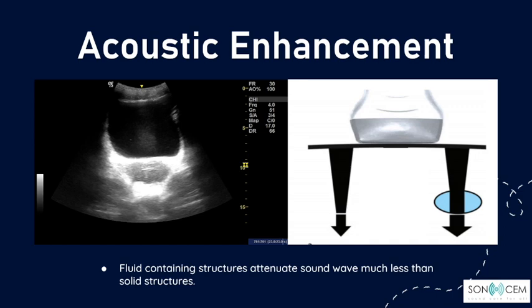Acoustic enhancement is the exact opposite of acoustic shadowing. This phenomenon occurs only in fluid-containing structures, whereby the ultrasound waves are least attenuated in fluid, hence allowing more beams traveling through it. As the saying goes, fluid is a good friend of ultrasound. The image here shows an acoustic enhancement posterior to the urinary bladder.